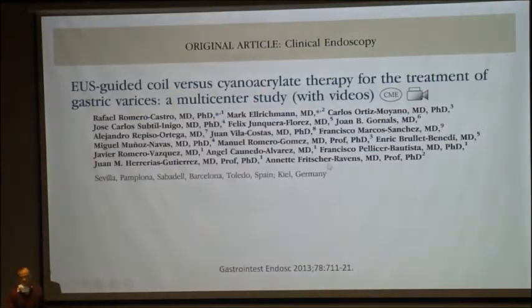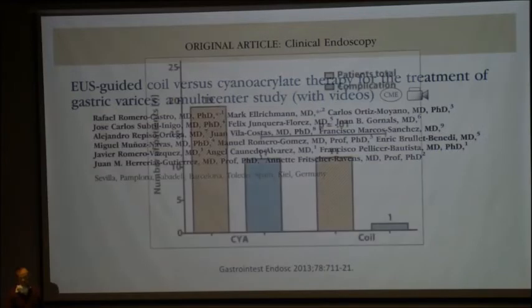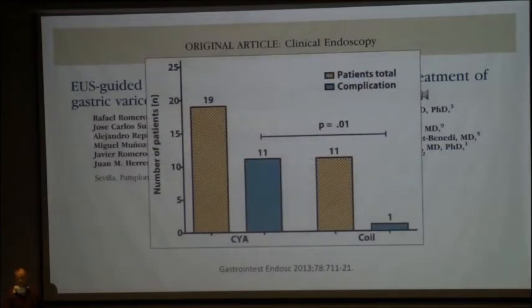So this was a retrospective study comparing EUS guided coil versus EUS guided glue therapy for patients of gastric varices. And in this, the success rate was the same from both the modalities. However, the rate of complication was less with the EUS guided coil injection.